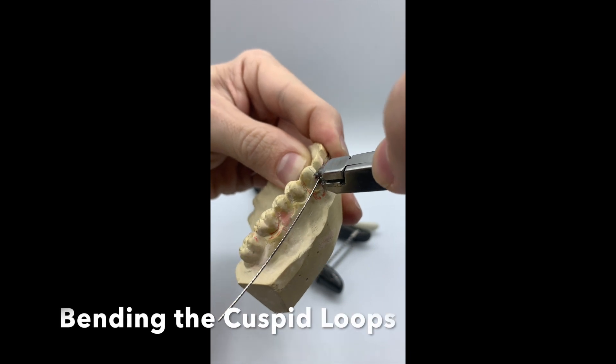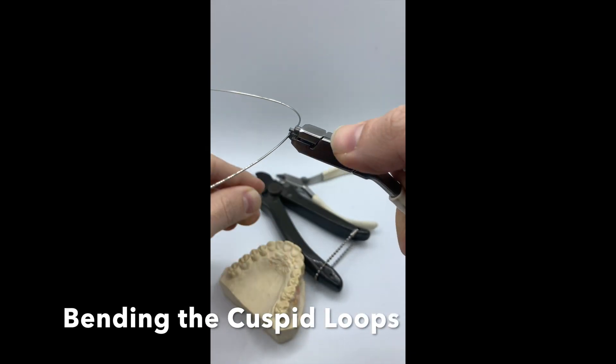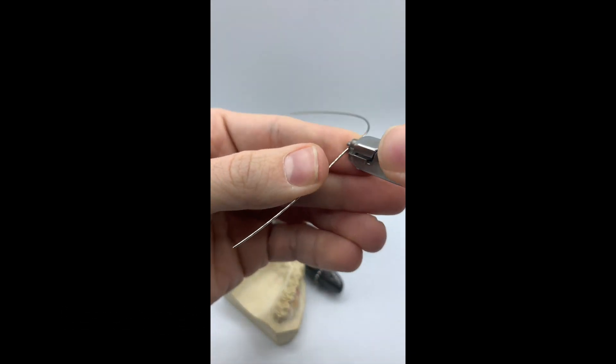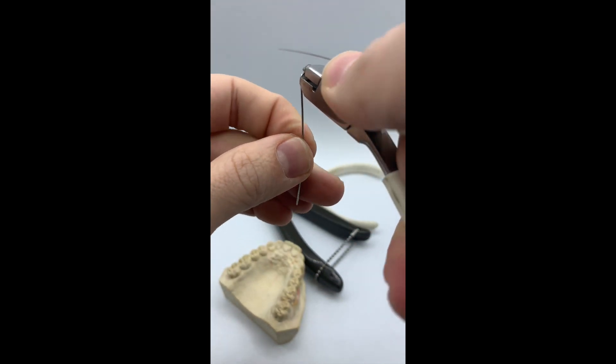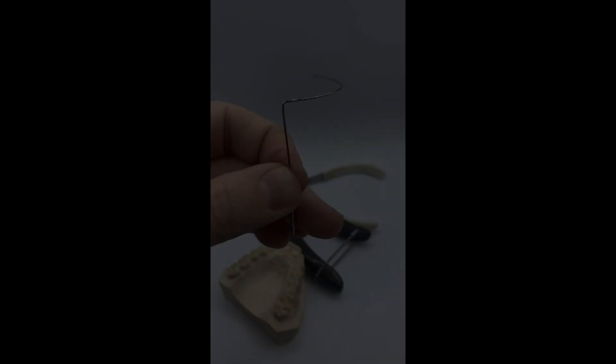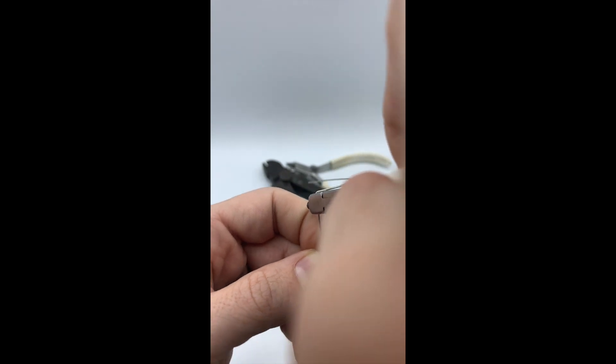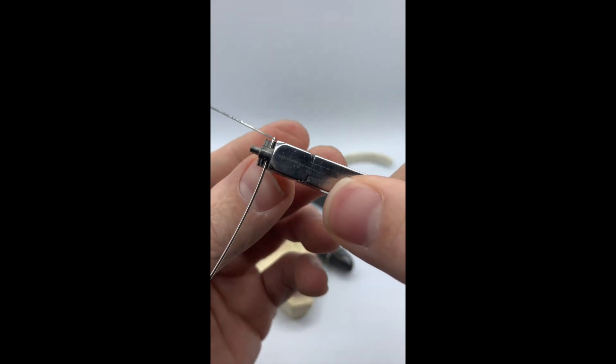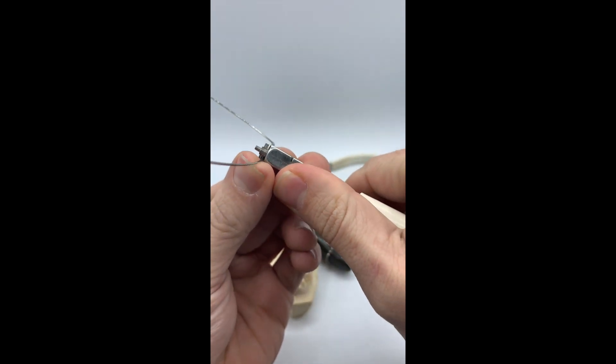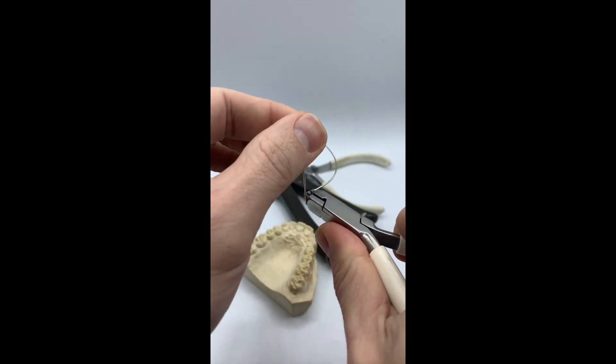For the cuspid loop, you want to make a 90 degree bend down with the wire at the line that you made. Now you want to make your loop. In one movement around your plier, bend the wire around your loop forming plier.